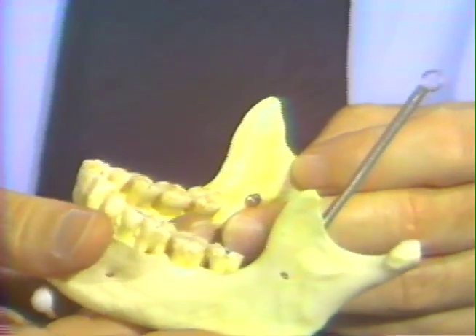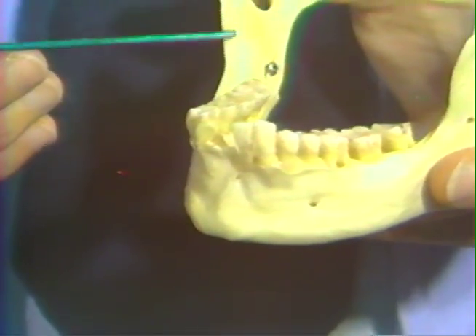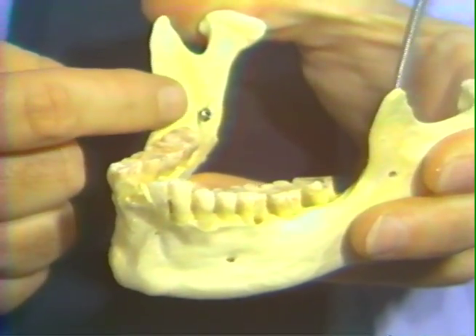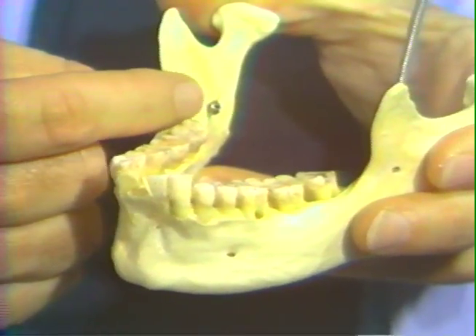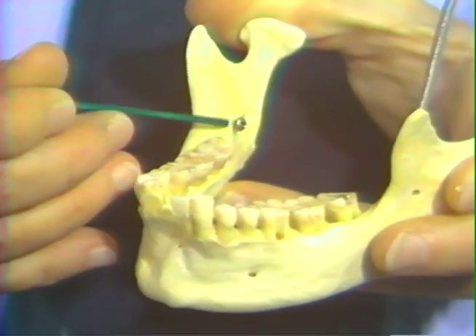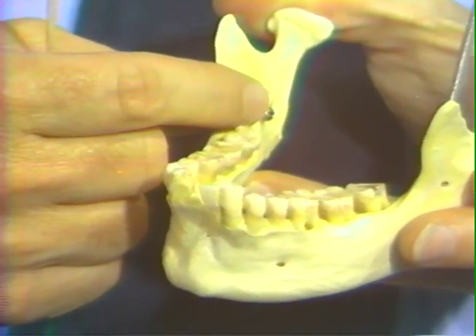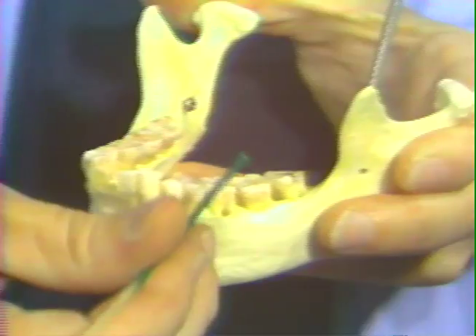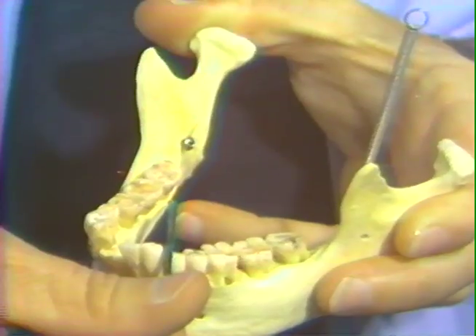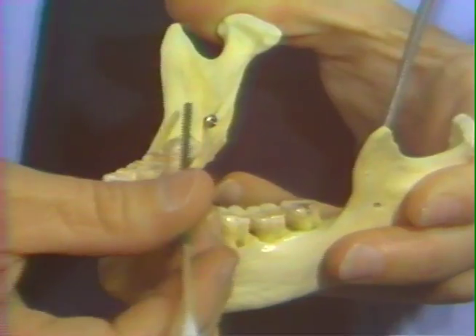The anatomical landmarks, once again, on the mandible. The anterior portion of the ramus, the deepest portion being known as the coronoid notch, which is palpated with the palpating finger. The innermost portion, the medial ridge, known as the internal oblique ridge, is the primary point to palpate for this injection. The needle direction is then passed approximately over the bicuspid teeth of the opposite side to the area of the internal oblique ridge.